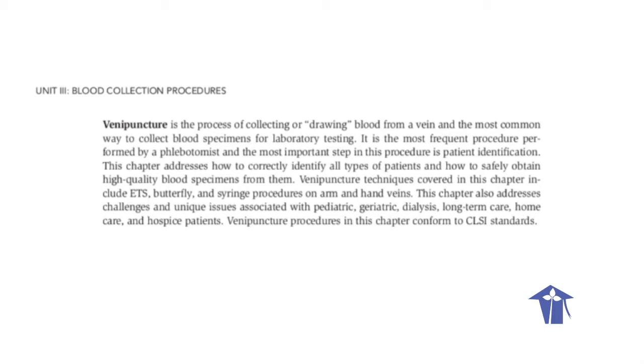But before we go to that, let's talk a bit about venipuncture. Venipuncture is the process of collecting or drawing blood from a vein and the most common way to collect blood specimens for laboratory testing. It is the most frequent procedure performed by a phlebotomist, and the most important step in this procedure is patient identification.